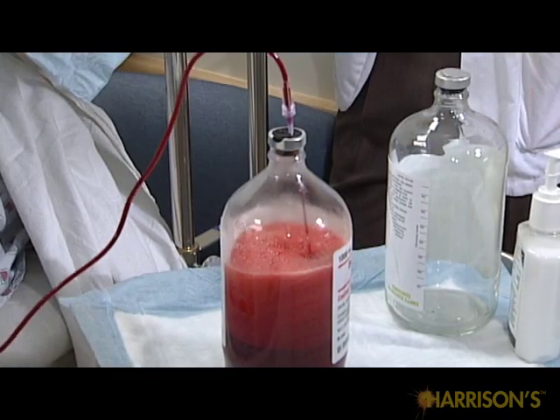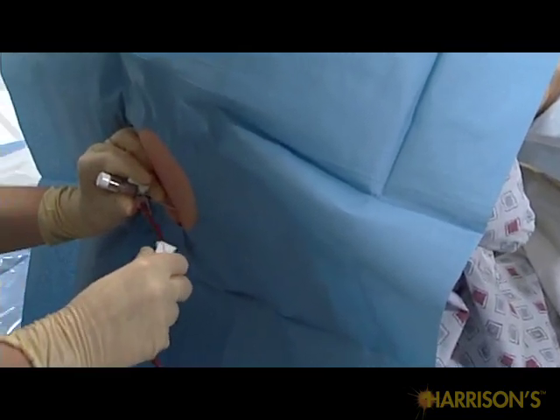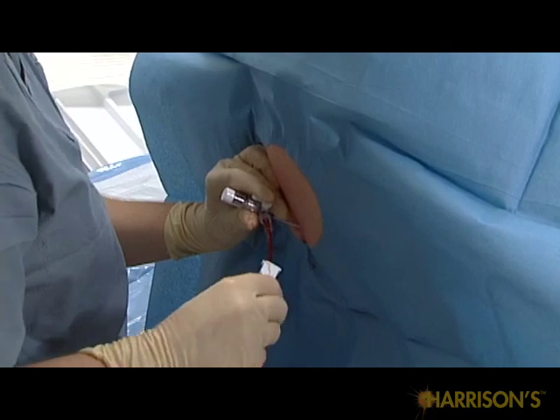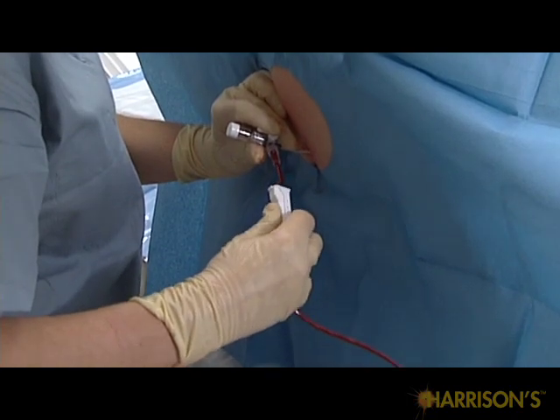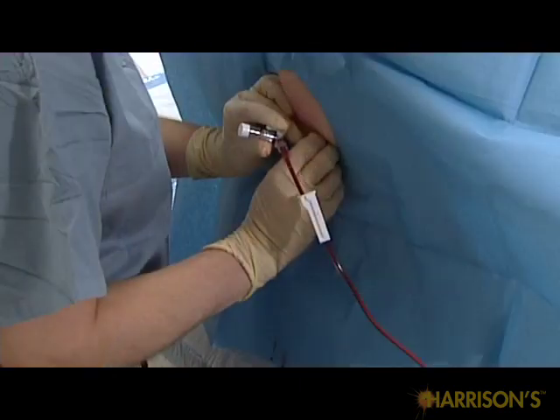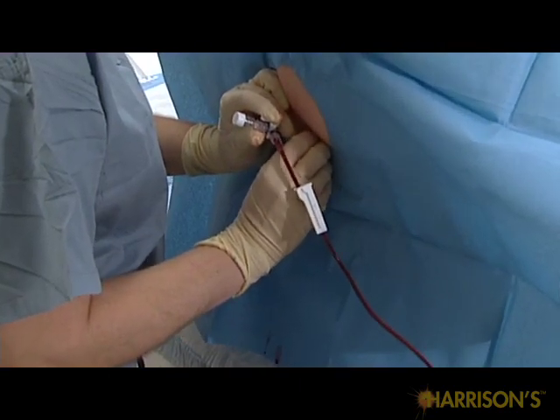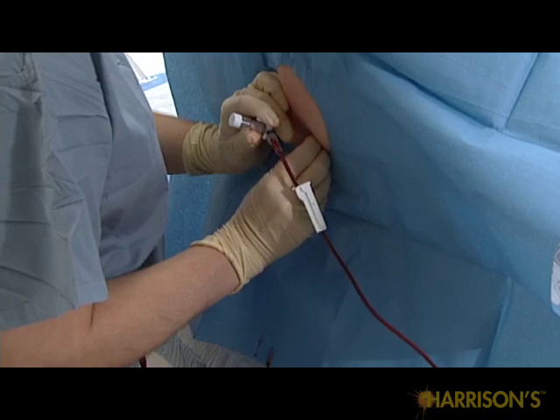If you notice air bubbles coming through, use the roller to stop flow. Tighten all connections and try again. If air bubbles persist, try switching containers, always stopping flow while exposing the end of the tubing to air to avoid pneumothorax. If bubbles still persist, stop the procedure and have the patient undergo a chest X-ray to rule out pneumothorax.